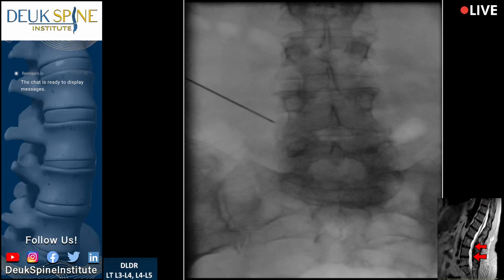I'm getting closer. You can see the facet joint right at the tip of the needle is hypertrophied. It's enlarged. Go ahead and show them that facet joint. We're going to show you right now on that view of the X-ray the enlarged facet joint. Show them that. There you go. Yeah, it looks like a semicircle right there. Yep, it looks like kind of a balloon, and we're about to pop it. That balloon is actually bone, and it's really the facet joint at L4-5.